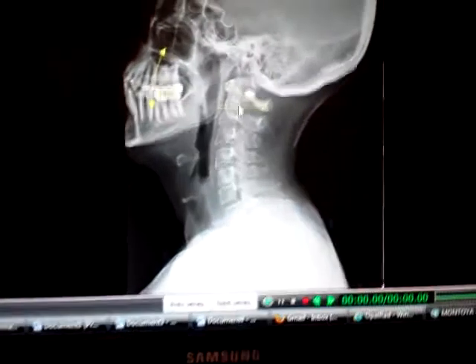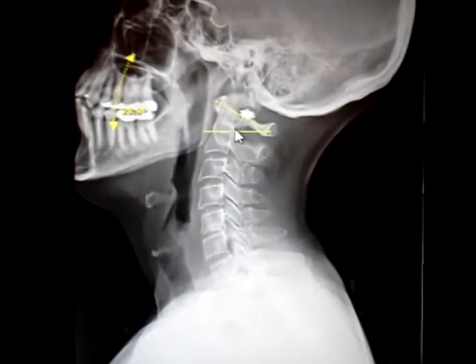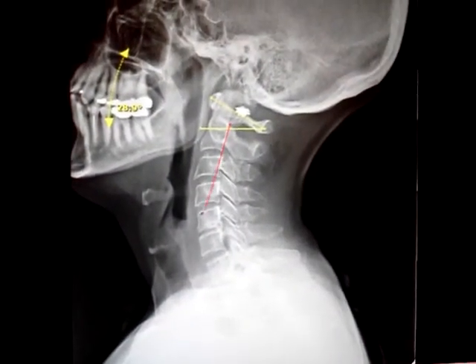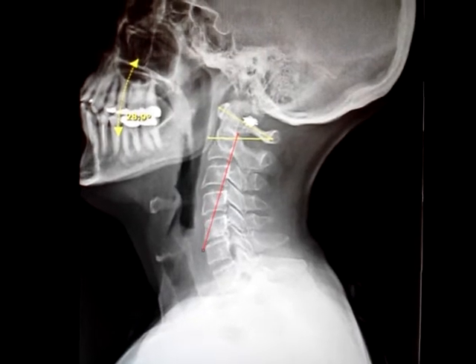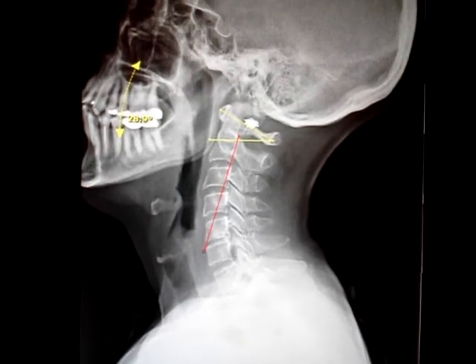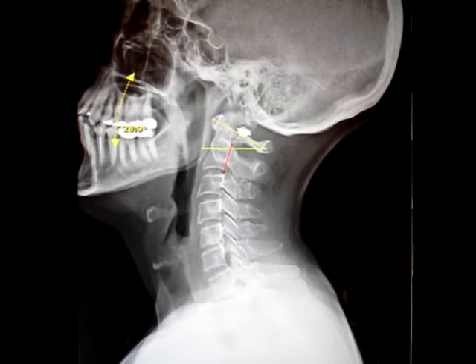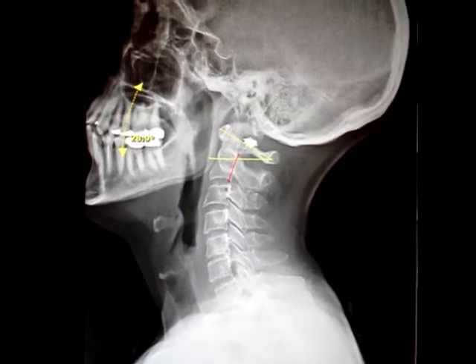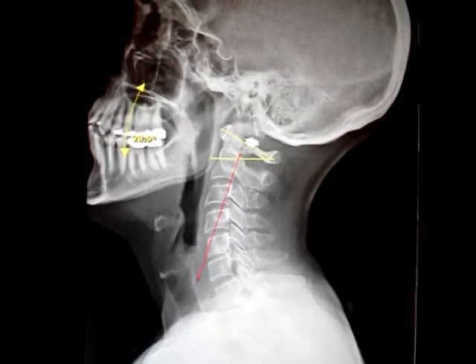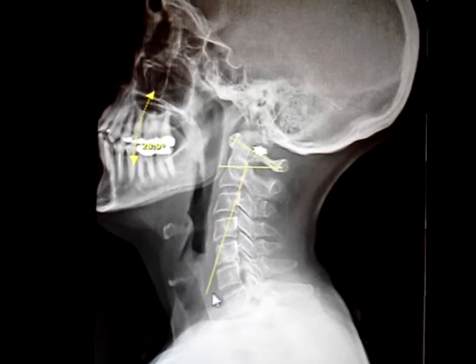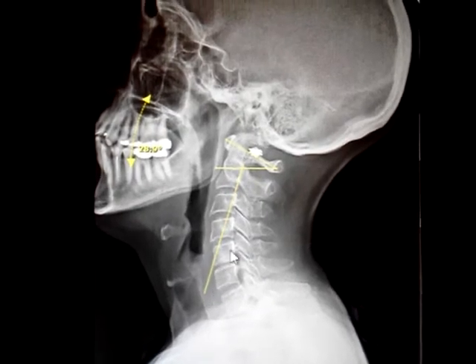Now go over to the bottom left to the slanted line here. Click on the posterior body of C2. Follow it and trace it down so that the line runs through it, and extend it. Really all you need to do is this, except that the lines may not intersect, so you just extend it down arbitrarily toward the bottom of the spine. You do the same at C7.